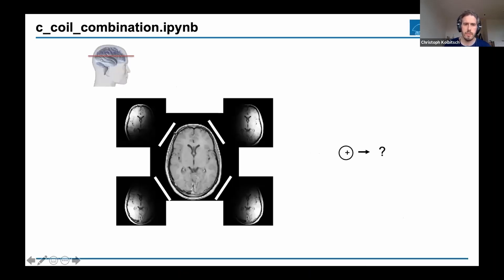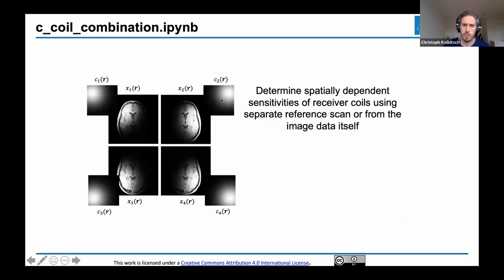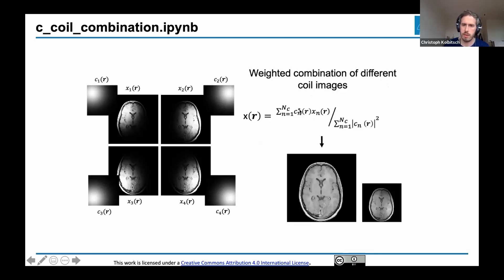In the notebook, we looked at different coil images as an example for a brain image with four different receiver coils. Each creates a k-space, and each k-space reconstructed shows a different part of the image because it's only sensitive to a certain part of the brain. We looked at how to combine those by calculating coil sensitivity maps, which give spatial information about where each coil is sensitive.